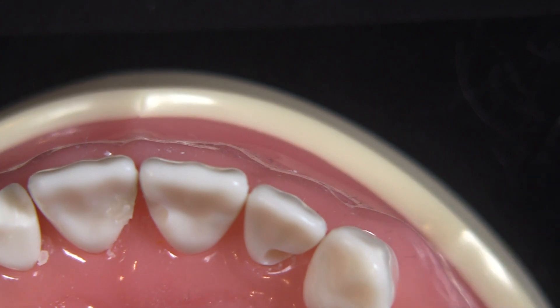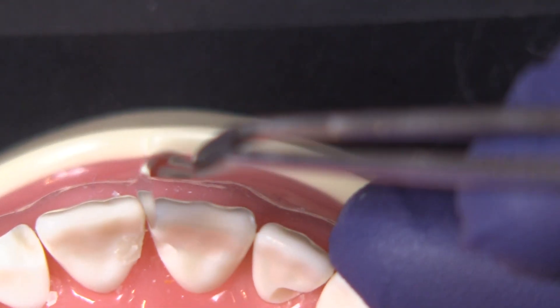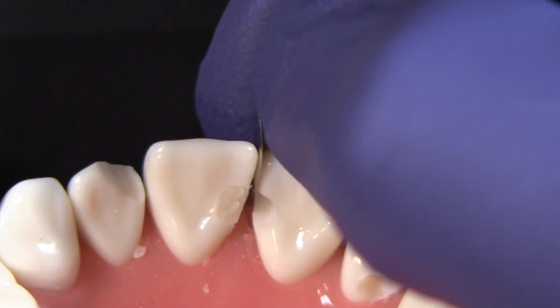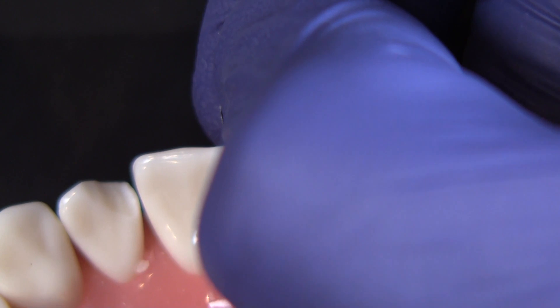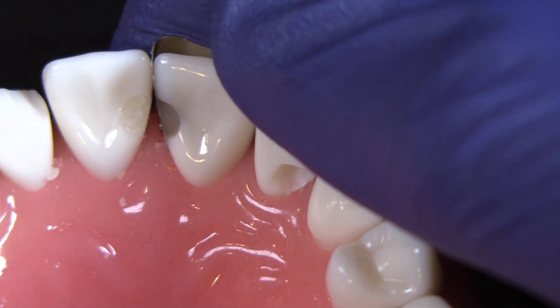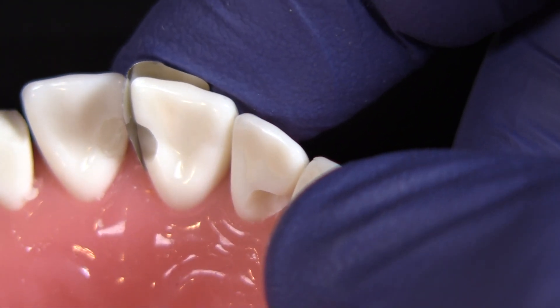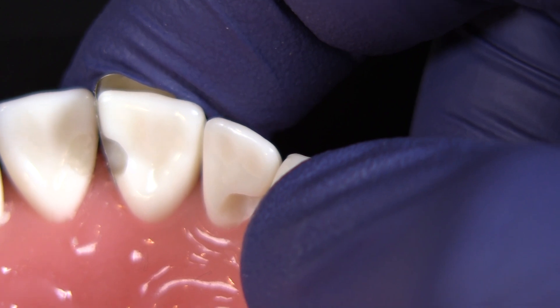Are you finding these to be fairly easy to get the band into the sulcus? Sometimes it could take just a little bit of repositioning — for example, on number nine here, if I put it straight down through the contact, sometimes it'll slip right into that sulcus. Other times it won't, and so what I'll end up doing is placing it more from a facial position to really angle that in where I want it to be. But that right there is the most important part of restoring these: once you get that in there and get the wedge in, that tight seal towards the margin is taken care of. After that, you want it to be shaped nice and look nice, but having that tucked into the margin and not worrying about whether it's going to pull away or lift up is critical.